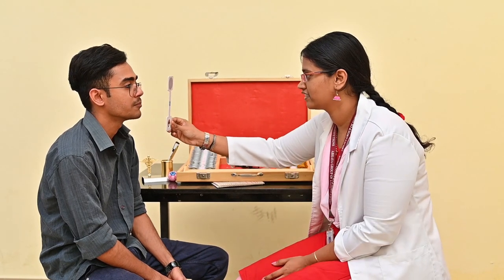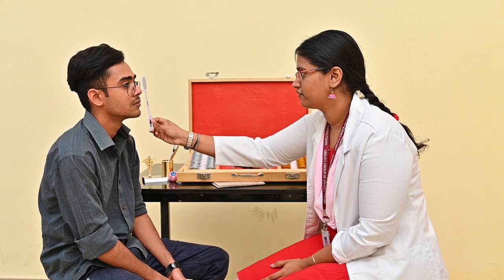Next is the cover-uncover test. Here we are going to detect phoria. Phoria is a hidden squint where you cannot find it just by looking at the patient. How to do it: when you cover one eye, you have to observe the same eye when you remove the occluder. I am giving the patient a distance target. I am closing the left eye, then removing the occluder from the left eye and observing it. Then I close the right eye, remove the occluder, and observe the right eye. If there is any movement when the occluder is removed, it is called phoria — it can be either exophoria or esophoria.